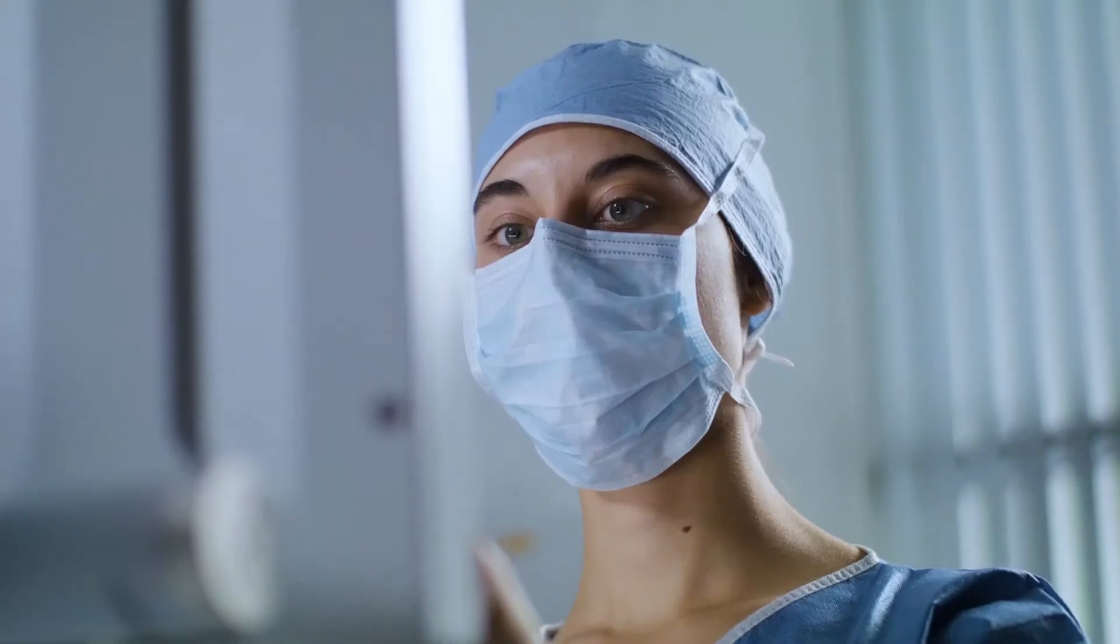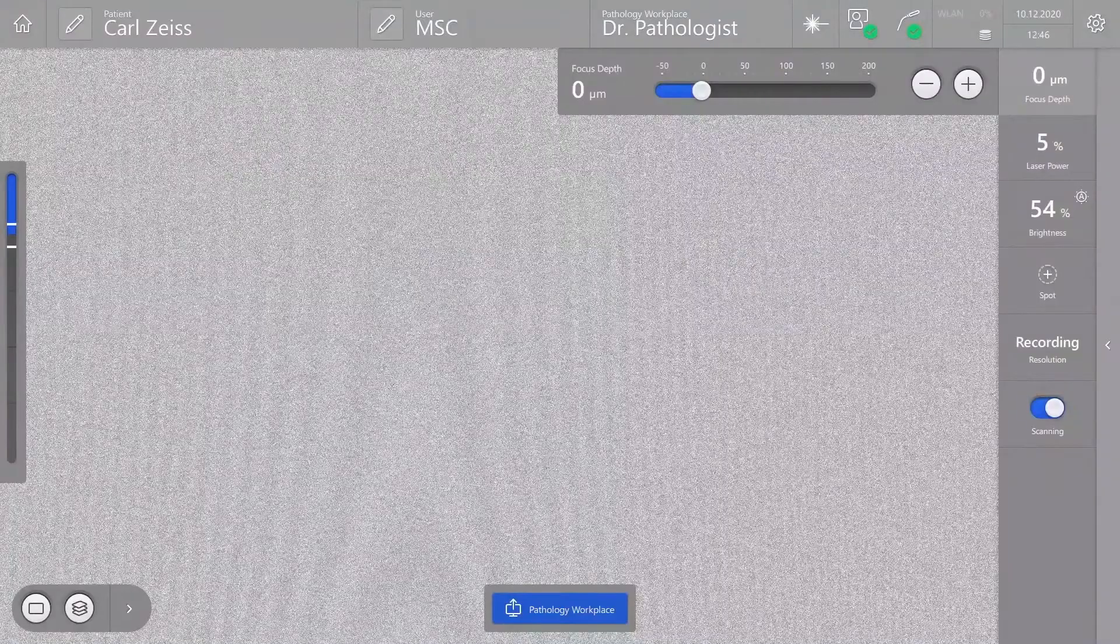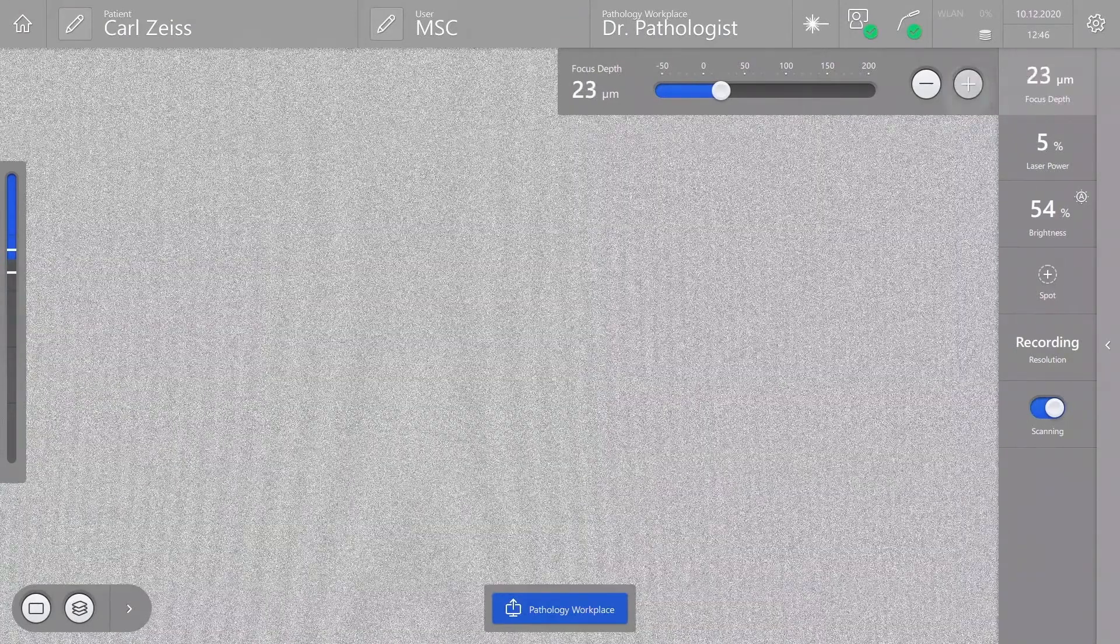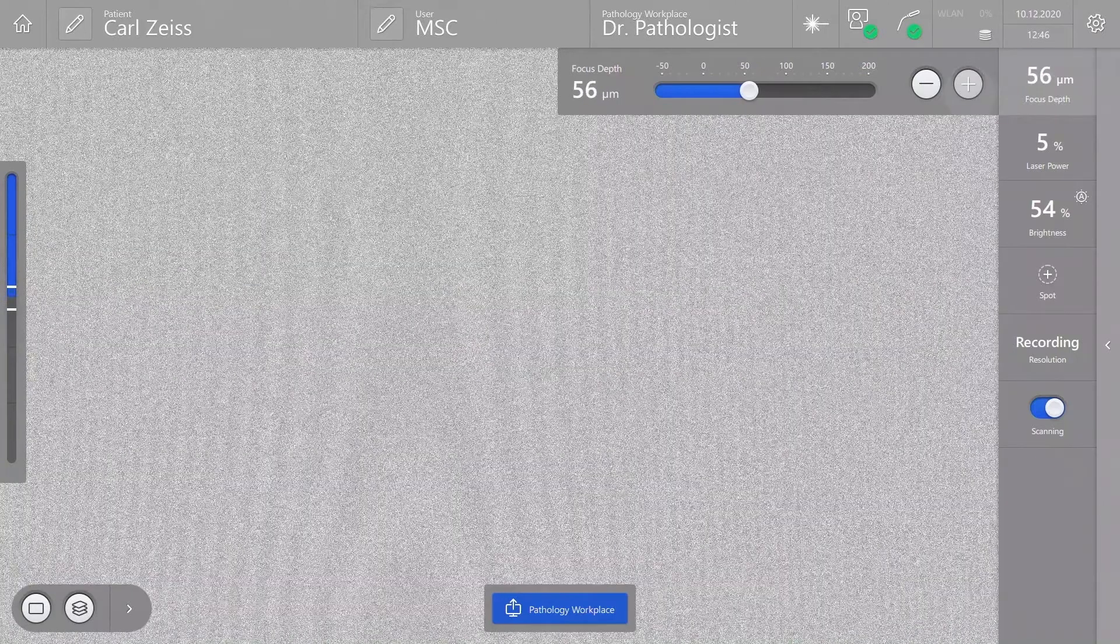Convivo allows for scanning in a focal depth range from minus 50 to 200 micrometers. In order to generate well-focused images of the scanned tissue, it is important to know at which focal depth the front glass of the sterile sheath is located.